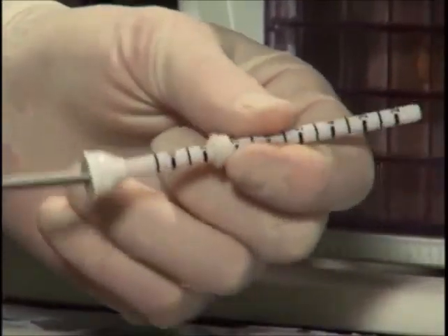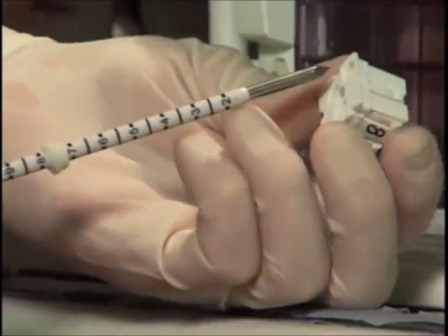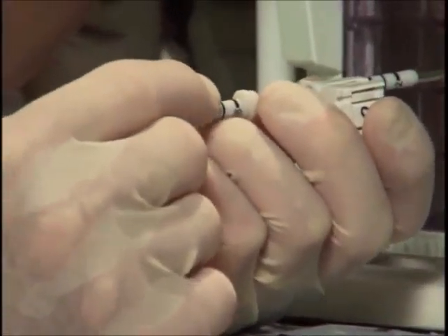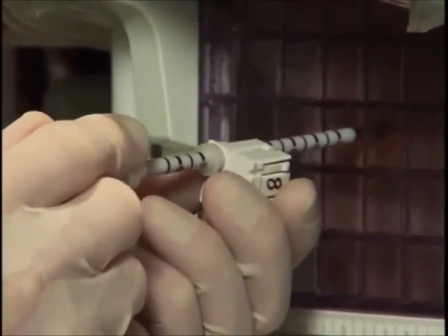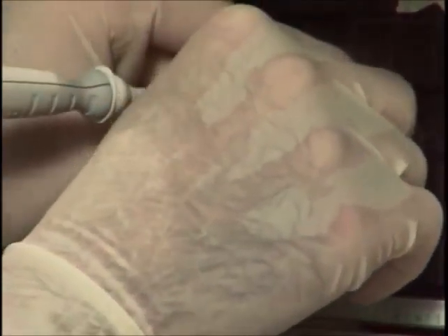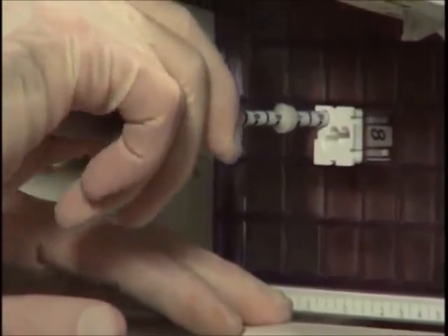Having set your depth, you then slide the trocar in place and introduce it first through your block. We advise doing this so that you're able to actually find the skin nick you've made, rather than putting the block in first and potentially missing the skin nick. Having done this, we first insert the trocar through the skin nick until we get to about the level of the sheath. At that point, make sure your block is firmly seated, then introduce the trocar with a gentle twisting motion, advancing to the depth you've determined on your biopsy plan.